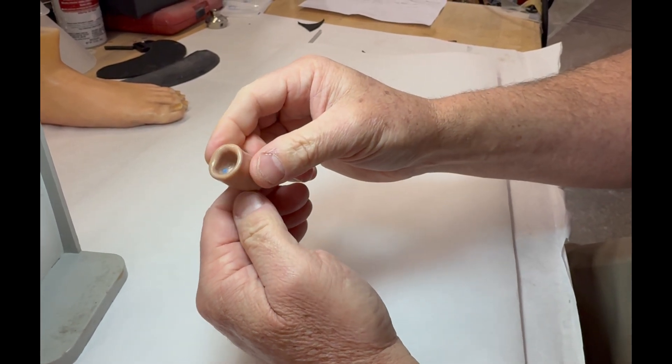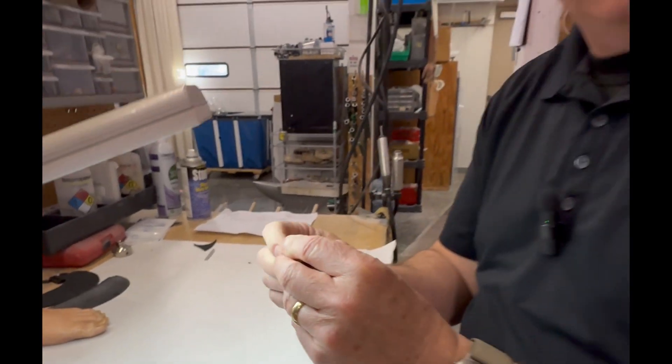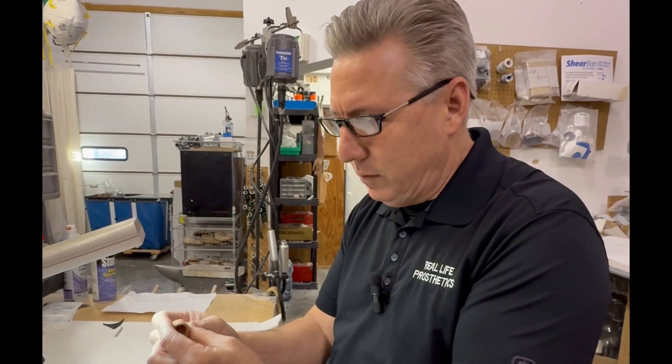Everything else looks good. I'll go ahead and spend some time working on this — about 15 to 20 minutes — and his finger will be in good working order, fitting and functioning as intended.